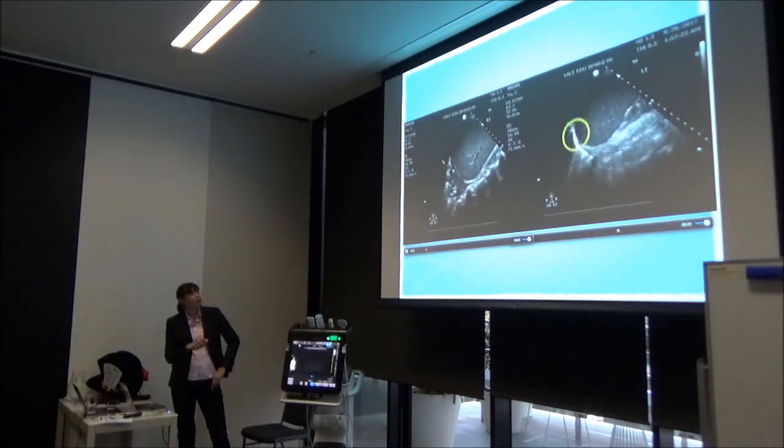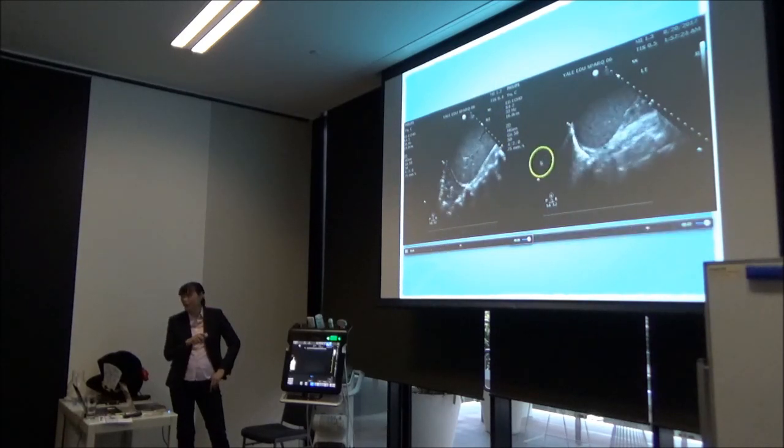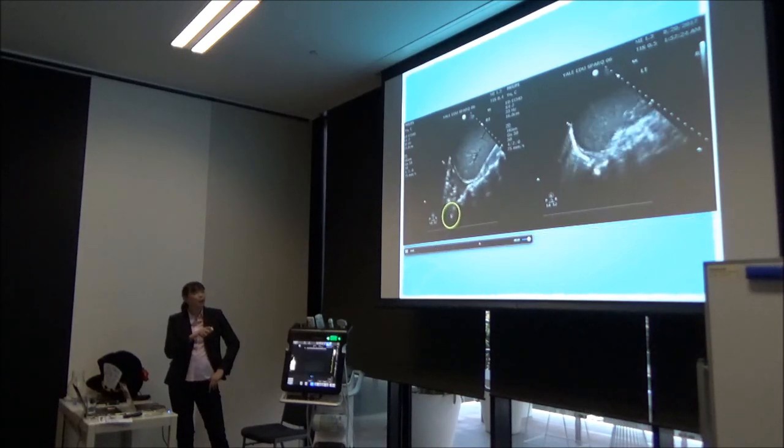This versus this. Consolidation. Yeah, so this is normal. Here is the right side, and I've got spine sign. This is my spine sign. When you see the spine sign, it means something is abnormal. I can explain that a little bit more.